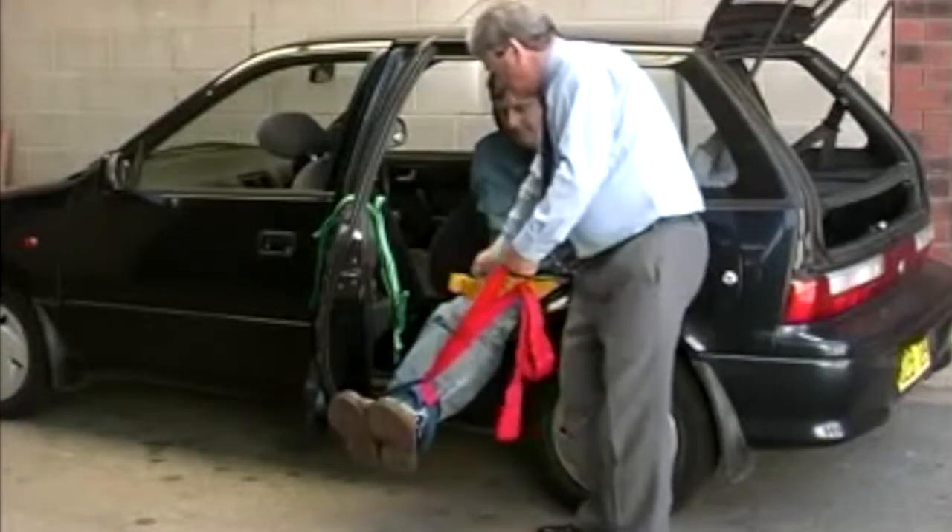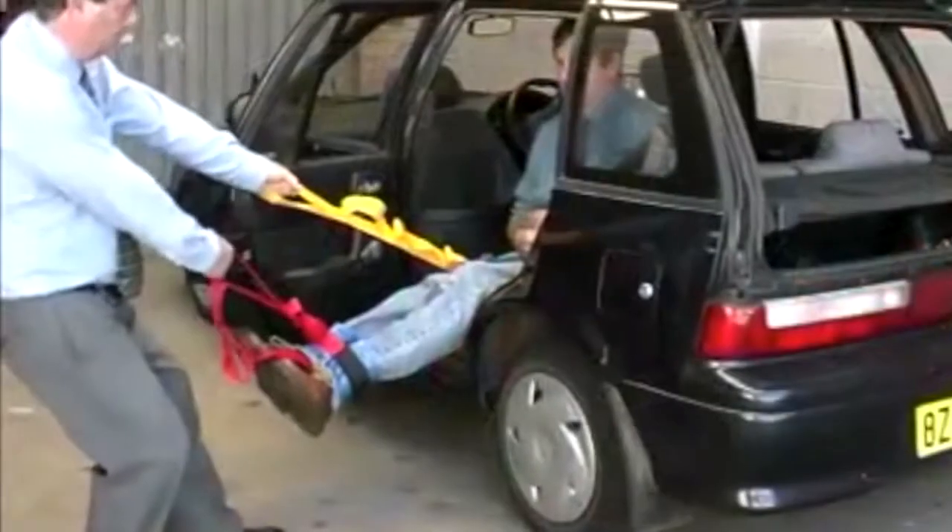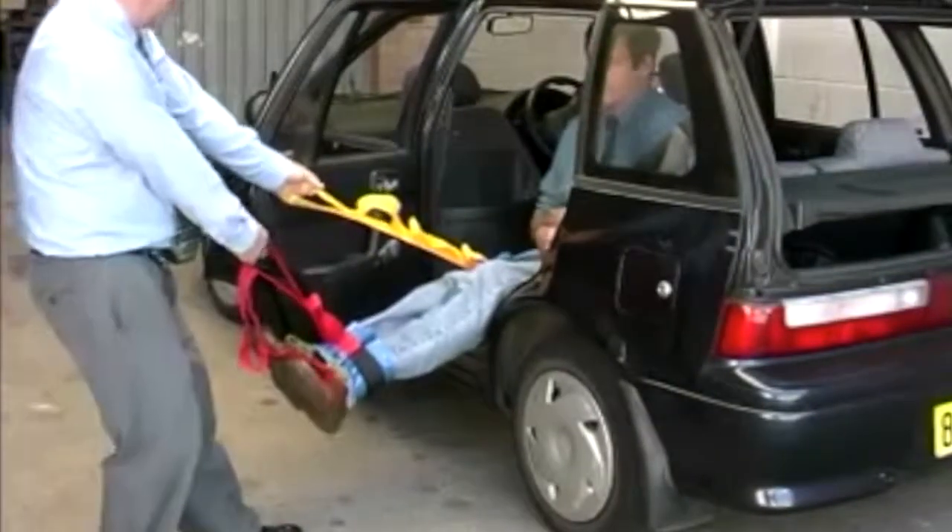When you are pulling, use your body weight. Keep your arms straight and just lean backwards. Your body weight will do the hard work for you.